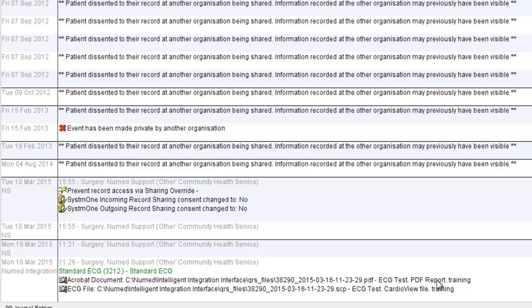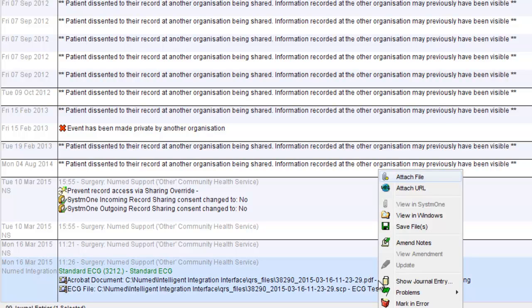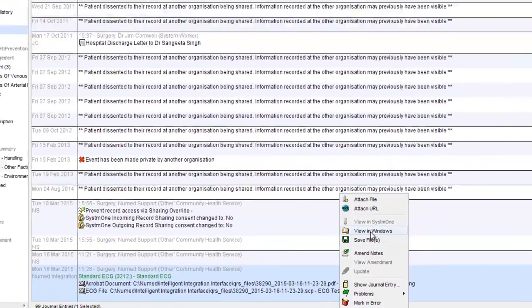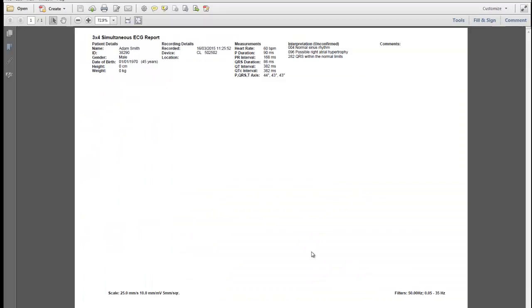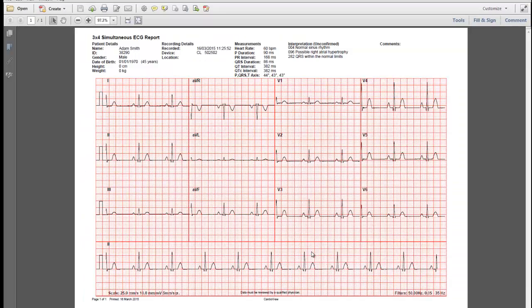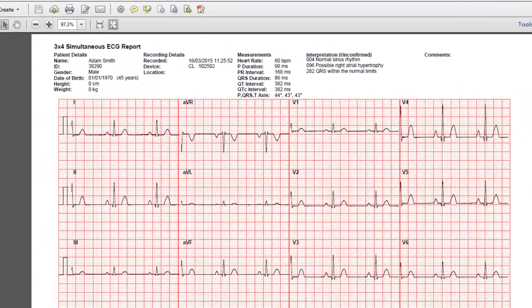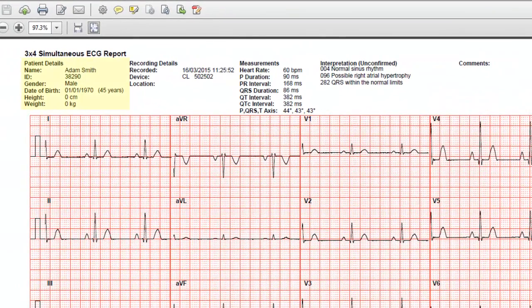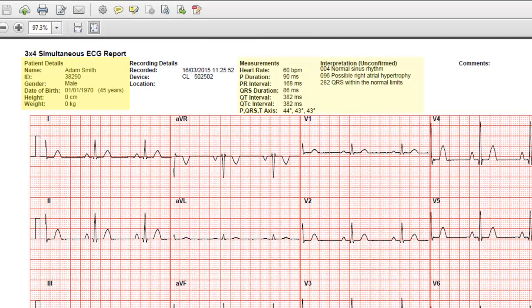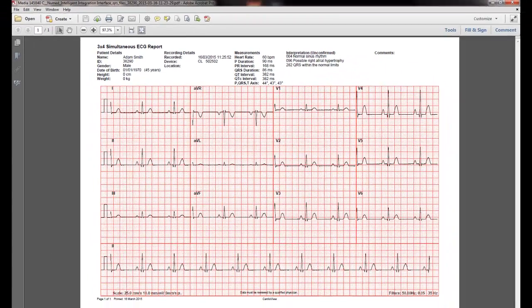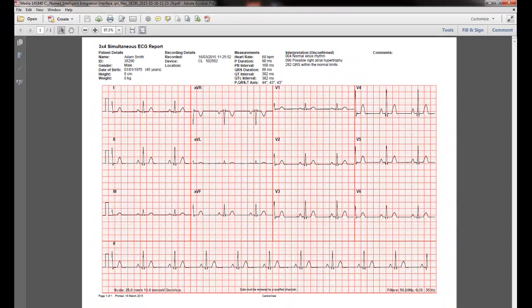To open the attached results, right-click and then select View in Windows. The report contains the patient's details, the average measurements and the system interpretation with a standard resting ECG report format. Beneath this is 2.5 seconds of every lead view with a 10-second rhythm strip of lead 2 along the bottom.